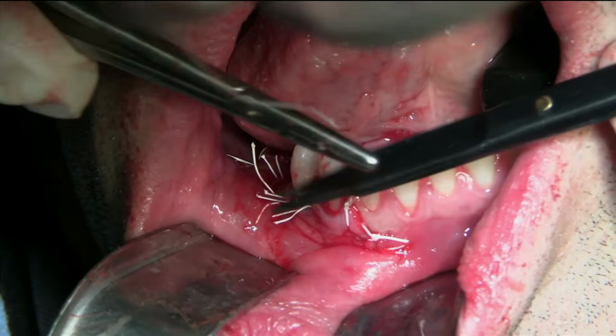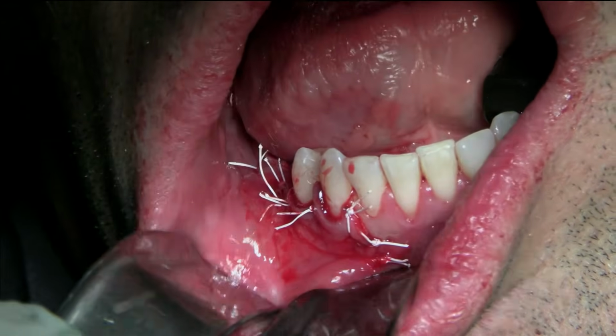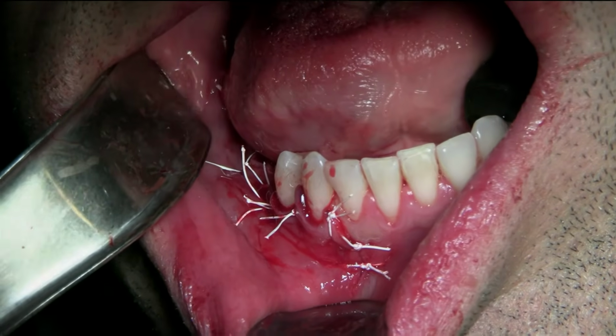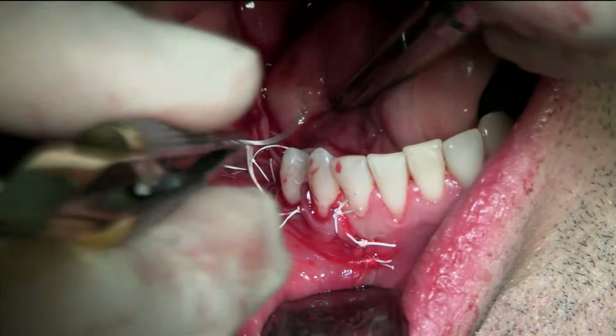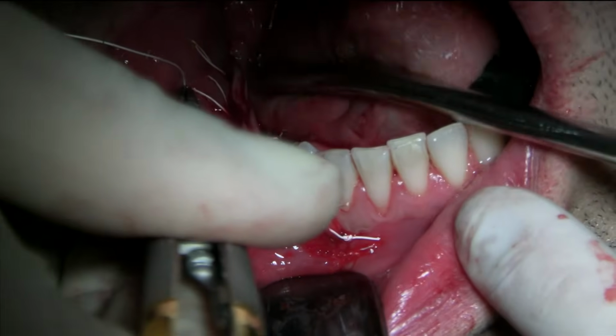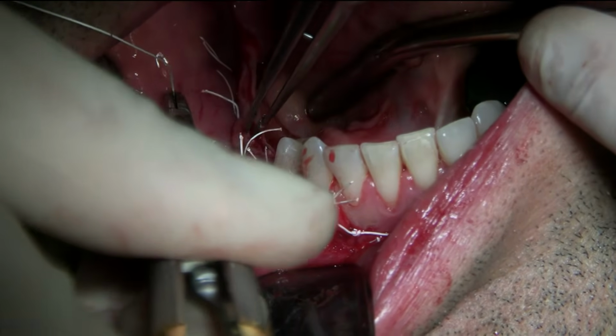Okay. Considering the fact that PTFE can reduce bacterial adhesion into small pores, can you tell us what your protocol is for managing the early exposure of the PTFE and later exposure of the membrane? Okay, so the question is, what would we do with an early or late exposure?